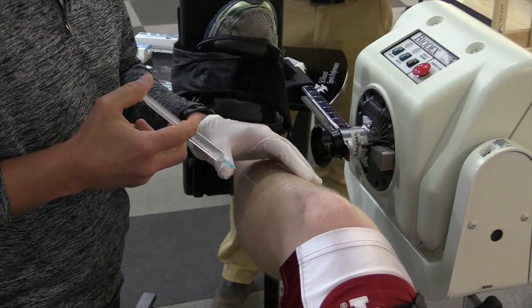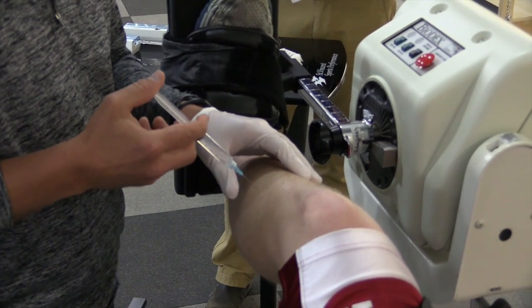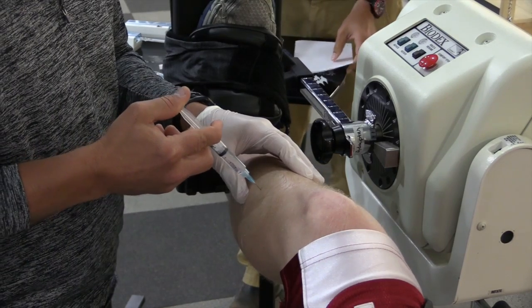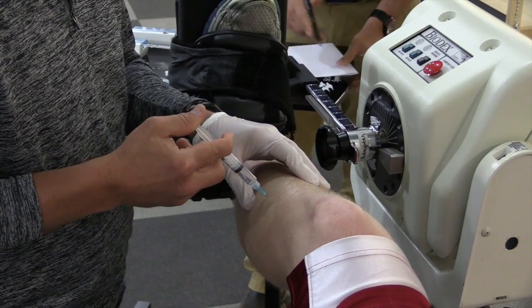Next, each area will be anesthetized with 1% lidocaine to numb the tracts into the anterior and lateral compartments.